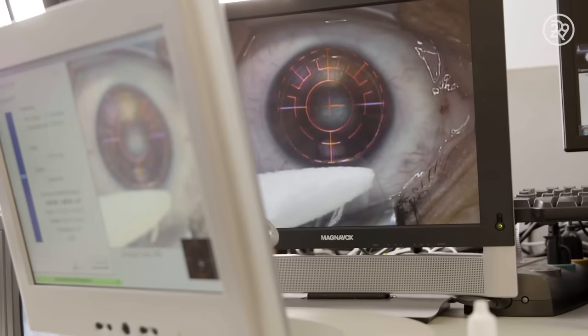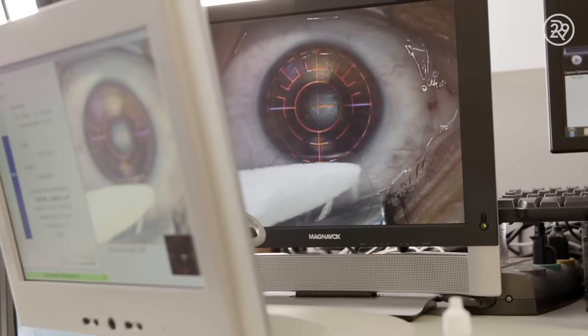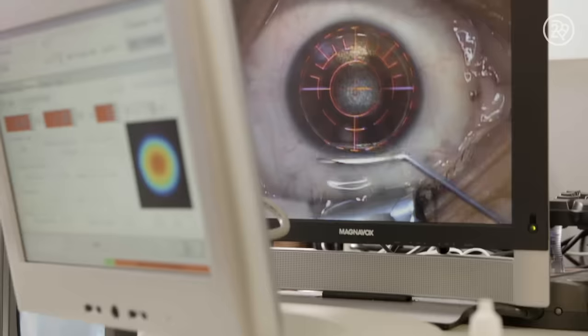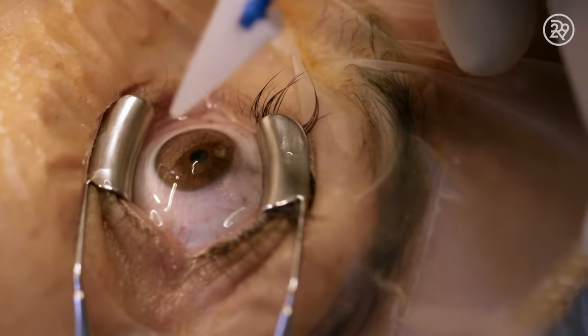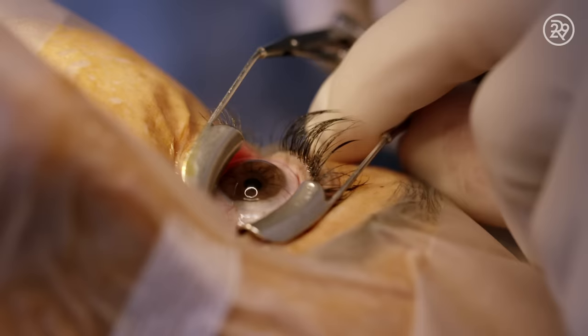Emily will hear a clicking sound while the laser reshaping is occurring. The laser tracks the pupil in a three-dimensional fashion. Any sudden movements or large movements actually shuts down the laser or shuts down the treatment. And then dry the edges to ensure that in fact the flap is well positioned back in place.